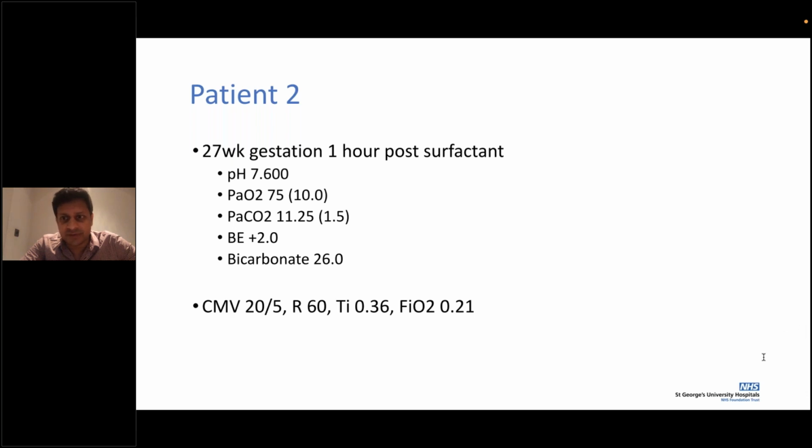I'm waiting for Amira to repeat that answer again. Okay. So Amira, increase your eye time. Now, increasing your eye time, so what would that do? That may not be a sensible plan, increasing eye time.